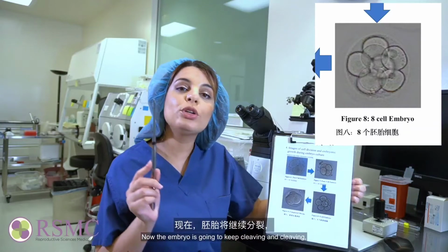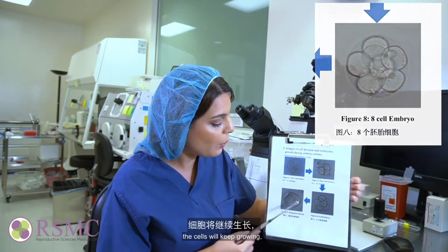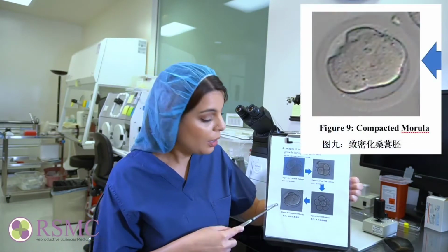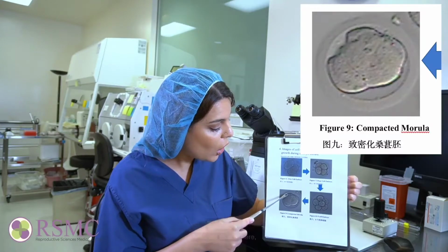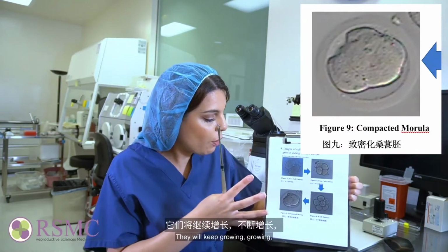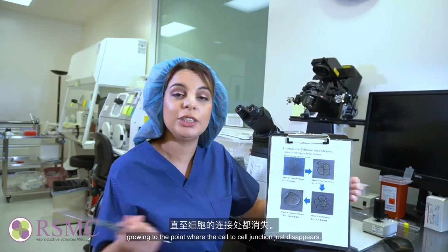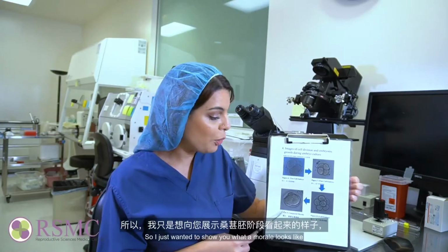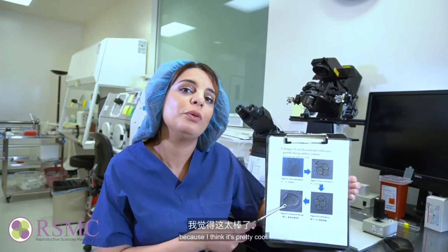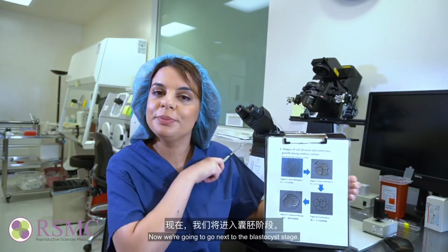That's what it's supposed to look like. Now, the embryo is going to keep cleaving and cleaving. The cells will keep growing until it makes it to this morula stage, which I think is pretty cool. Because look at here, all these cells are all compacted together. They will keep growing, growing, growing to the point where the cell-to-cell junctions just disappear. So I just wanted to show you what a morula looks like because I think it's pretty cool. Now, we're going to go next to the blastocyst stage.